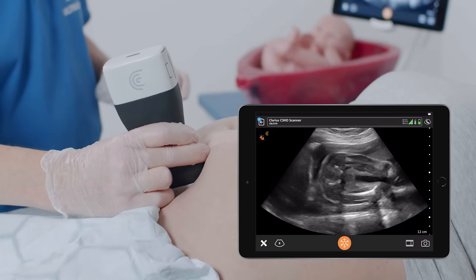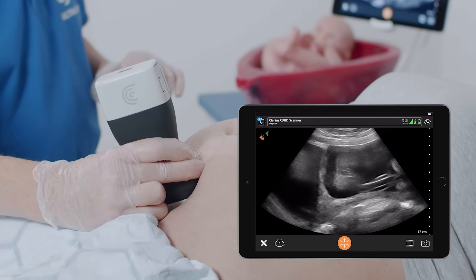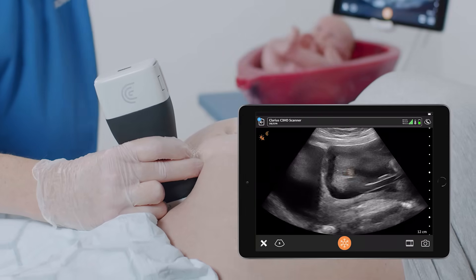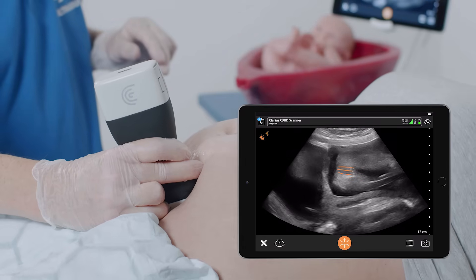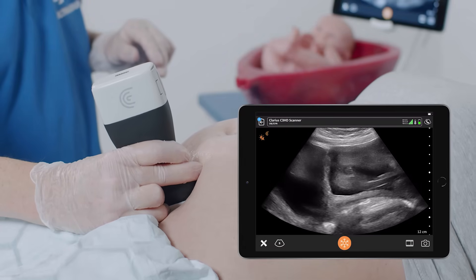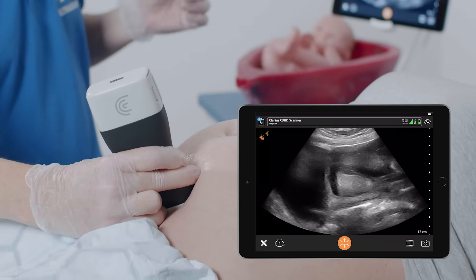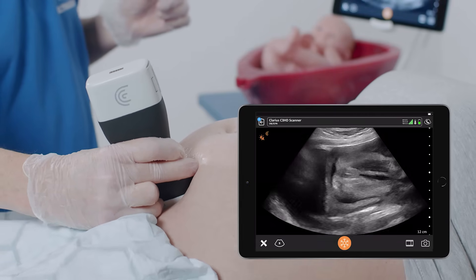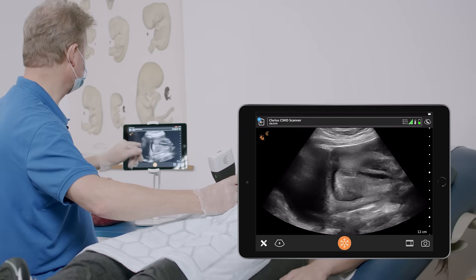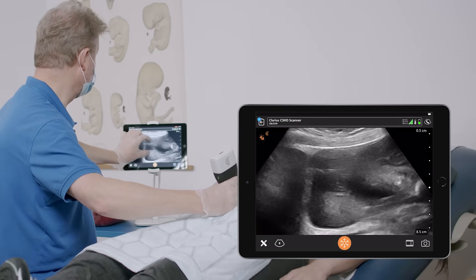I'm moving down and down, and as you can see this baby is trying to close the legs. But anyway, I can identify the lines of the labia, and it shows that in this case we are dealing with a female baby. As you can see, I will enlarge the image a little bit and improve this.